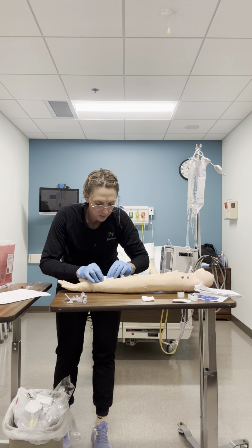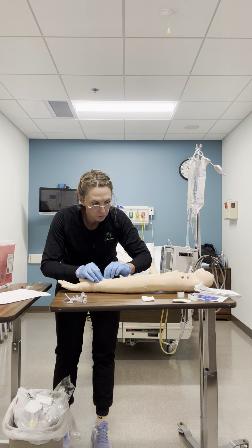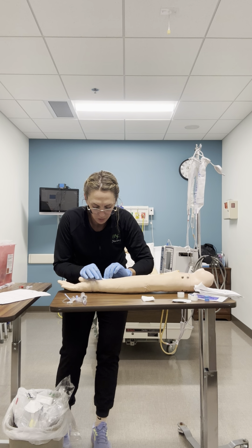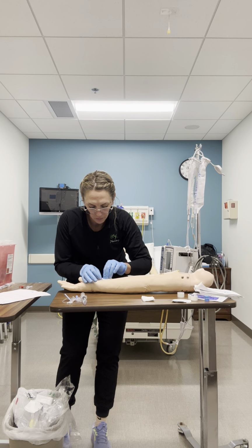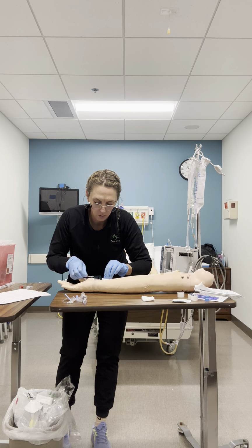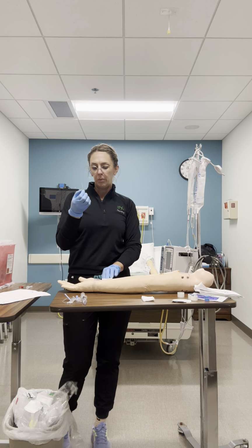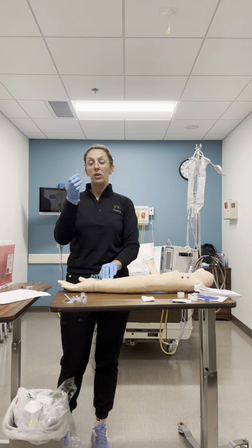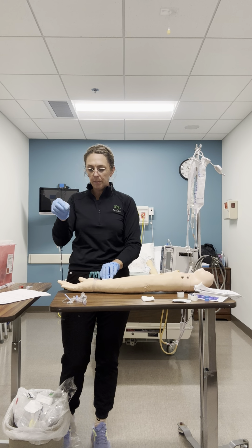I'm going to take my gauze and I'm going to place it lightly. I'm not putting pressure on, just lightly placing the gauze over the insertion spot. And then I'm going to pull the catheter out in one movement parallel to the arm. So I'm going to pull it out and I am going to put pressure and I'm going to inspect the catheter, that it is whole and that there's nothing missing from it. And it looks whole and there's nothing missing, which is great.